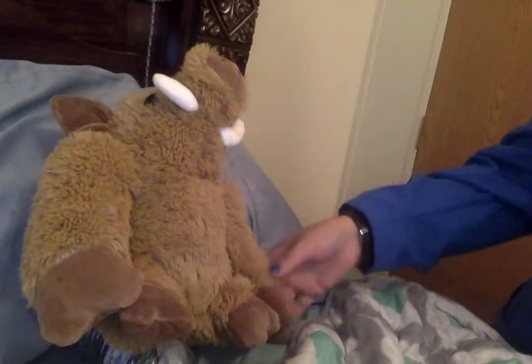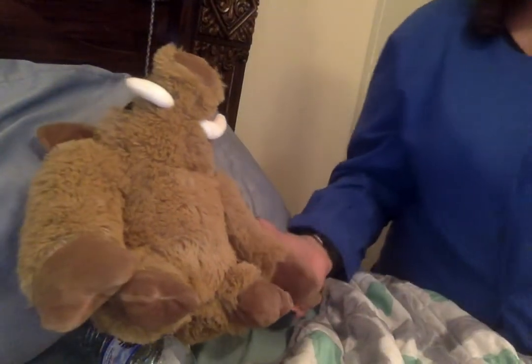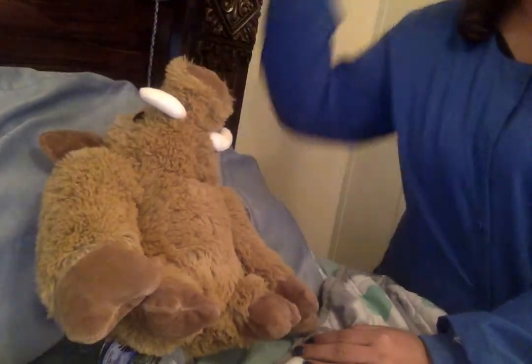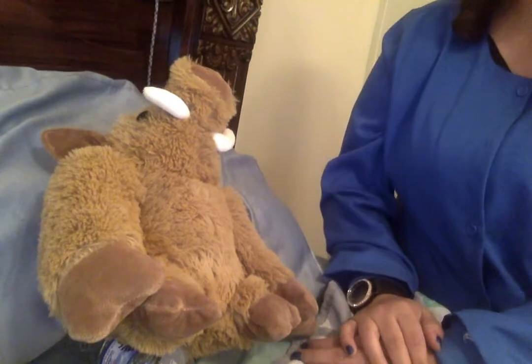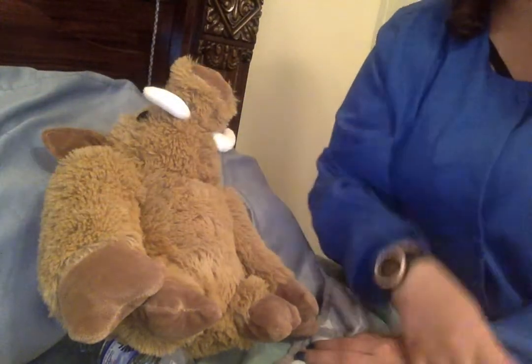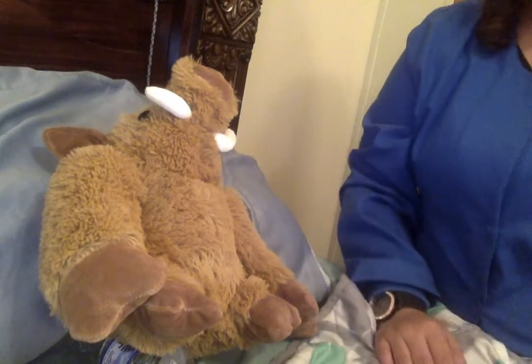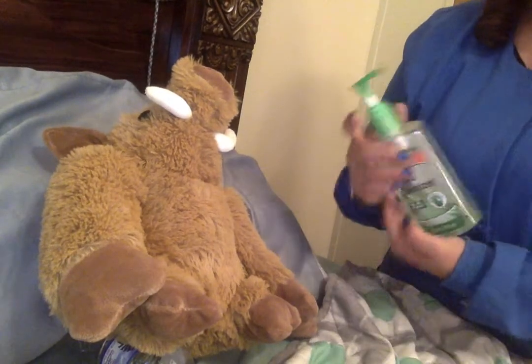So I just walked into the room. Hello, my name is Destiny. How are you doing? I'm doing good. Okay, well, I'm going to go ahead and provide for your patient privacy by closing this curtain. And then I'm going to do my hand hygiene.